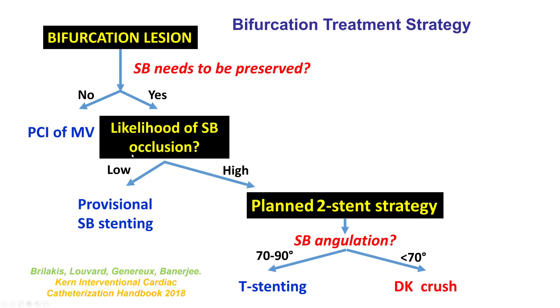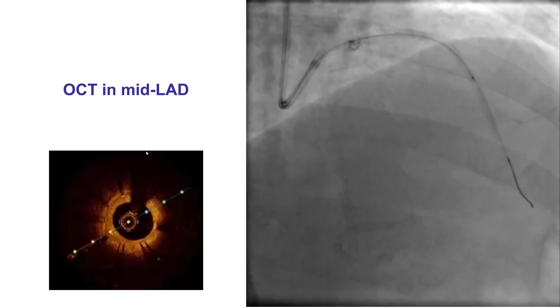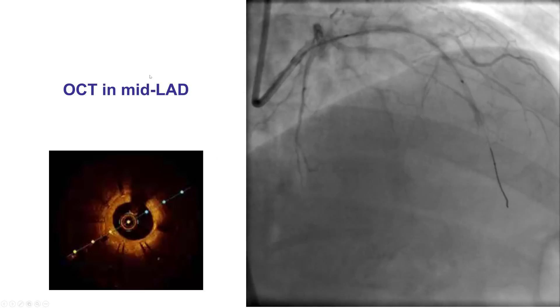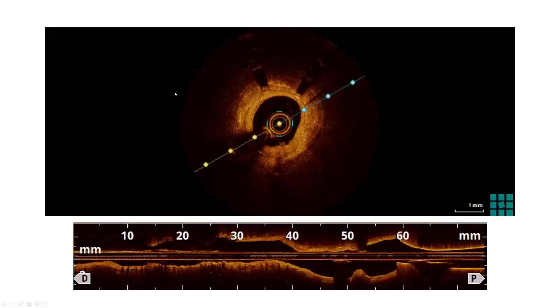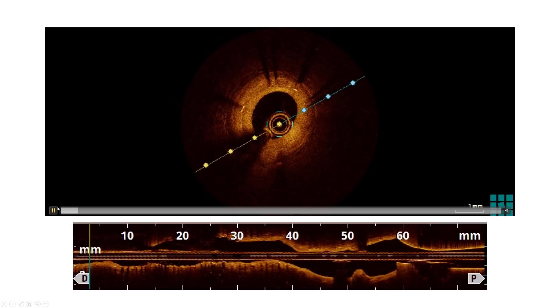In this particular case, there was some disease in the diagonal ostium, but we thought it was unlikely to lose it because the lesion did not appear significant angiographically. Therefore, we decided to do a provisional approach. We did balloon inflation in the proximal vessel, and then after wiring the diagonal branch, we performed OCT.